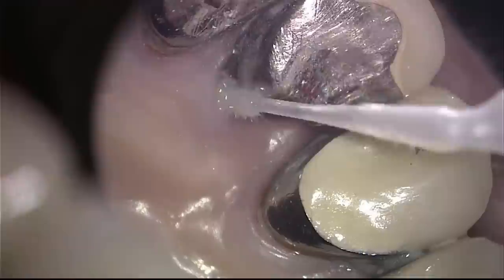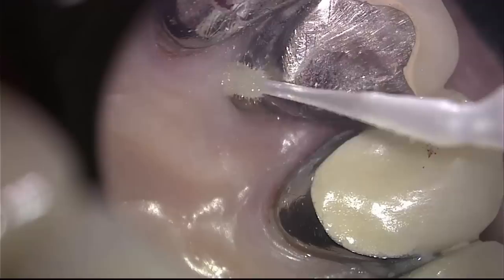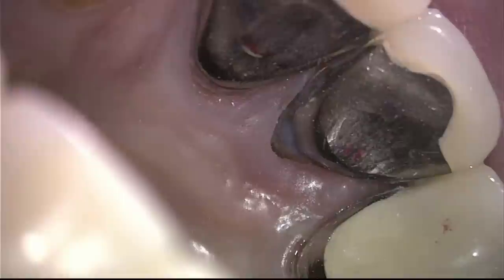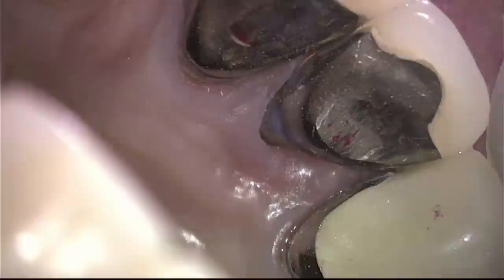So let me show you a few examples of why I use the microscope. Here is an individual with a crown on their front tooth. Looking in the mirror at the back of the root, you can notice some decay starting to destroy the root up above the crown. Using micro air abrasion, I can clean this root surface without using a drill, very conservatively. I can bond it and fill it using a permanent flowable restoration. In the end, I have repaired this root surface without using a drill — minimally invasive — and now this crown will have many more years of use without having to be replaced.